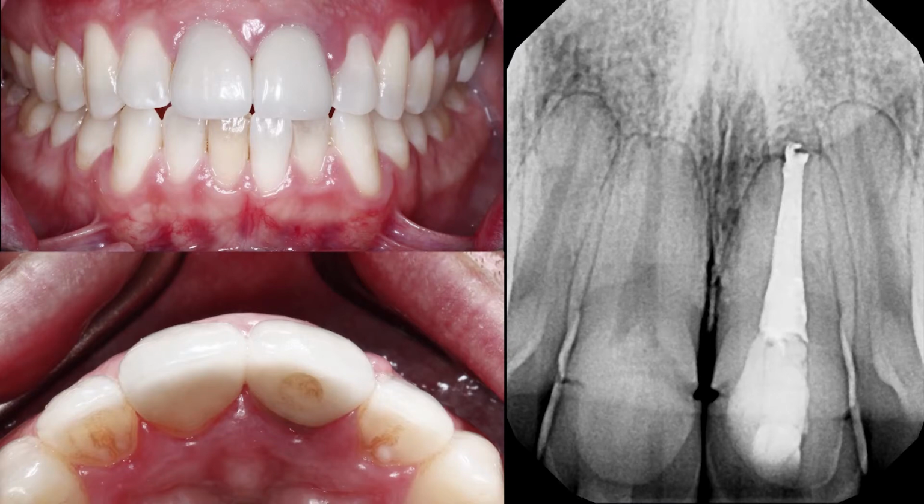And I had just recently had a patient come into the operatory with the chief complaint of teeth number 8 and 9. And the complaint was that the patient did not like the restorations any longer. Originally, the patient didn't like the restorations to begin with, but his treatment options were very limited at the time. He's had crowns placed on teeth number 8 and 9.